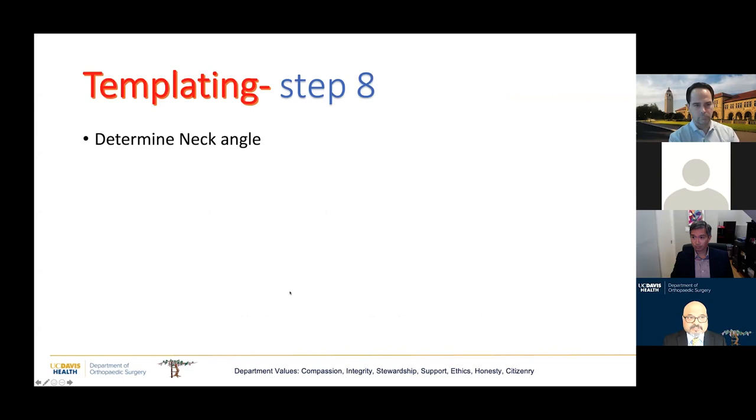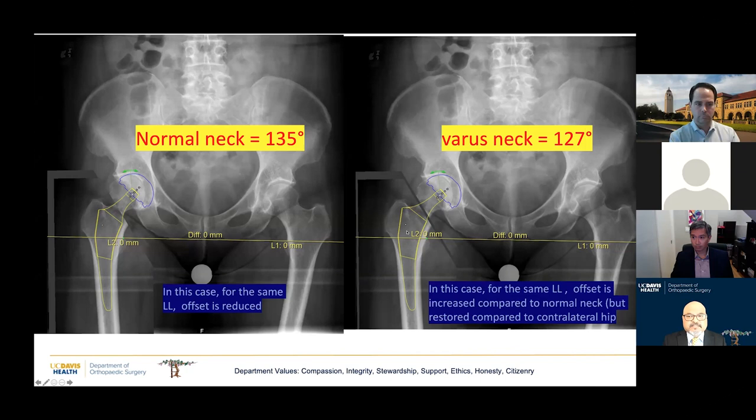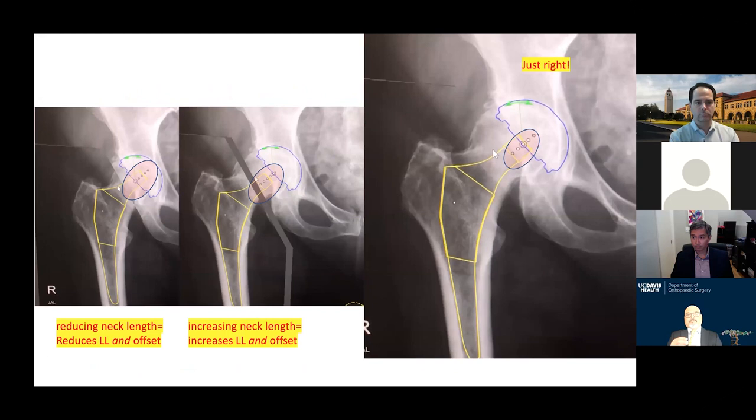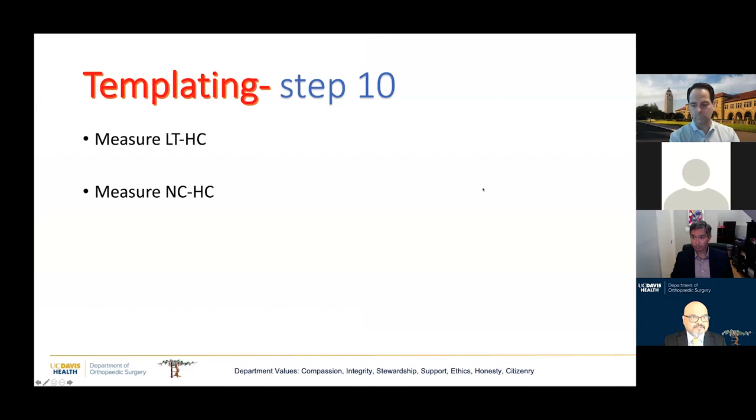The next two steps establish the patient's offset — related to neck angle and neck length. Most implants have a standard stem and a coxa vara stem, and you have to try both to see which allows you to choose the best offset and leg length. The neck length is inversely proportionate to the depth of the bore of the head — the deeper the bore, the shorter the neck length. We do a Goldilocks test to find the best neck length to restore offset.